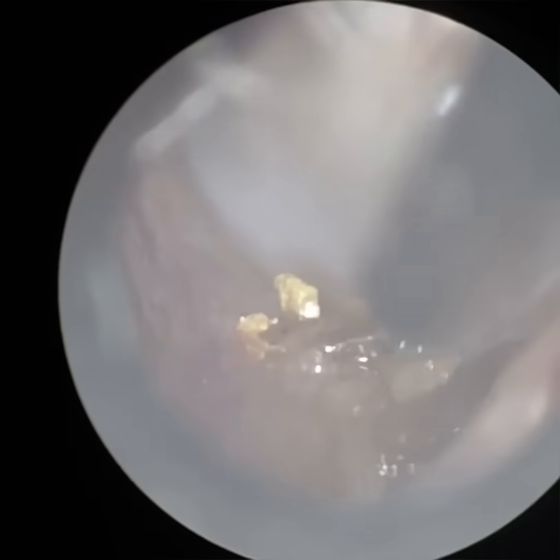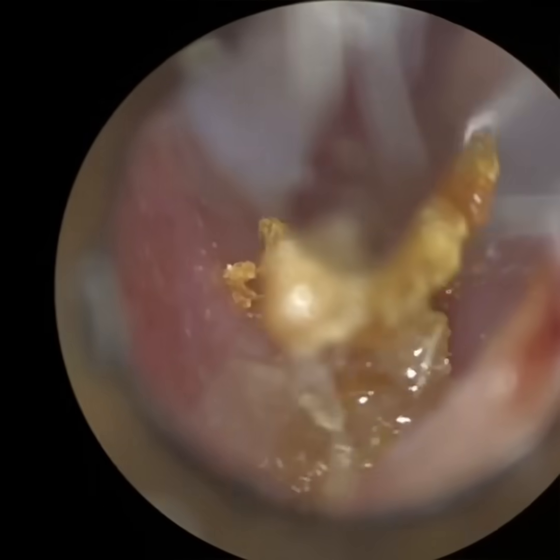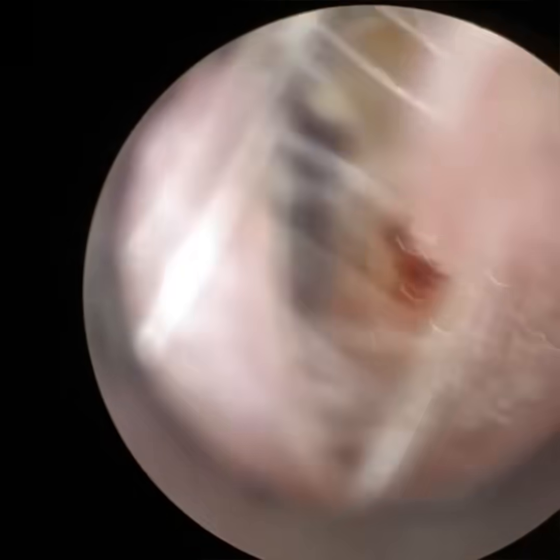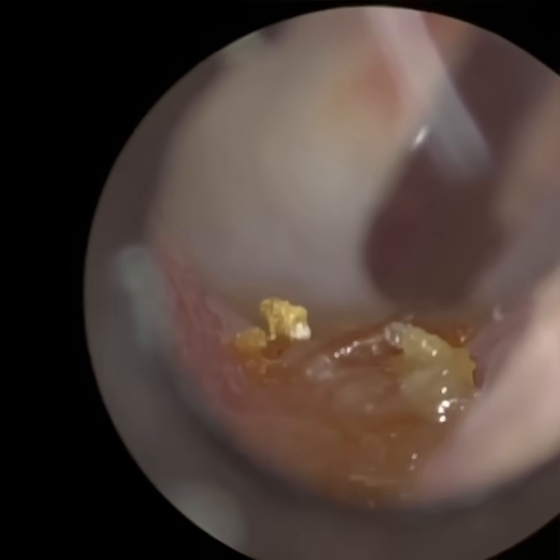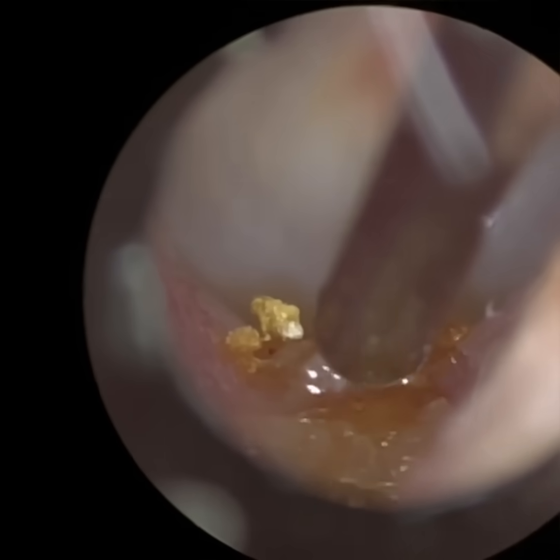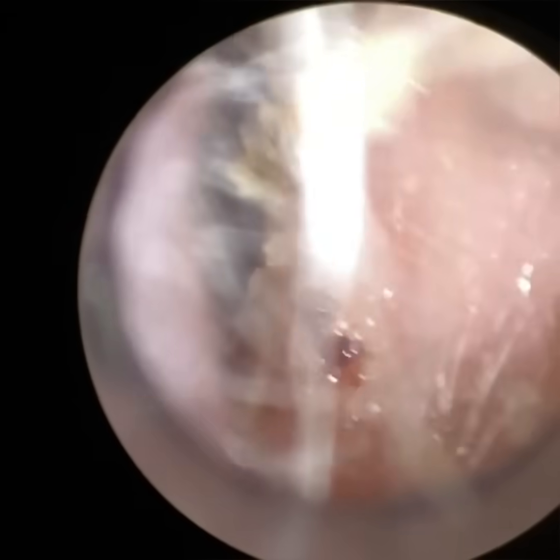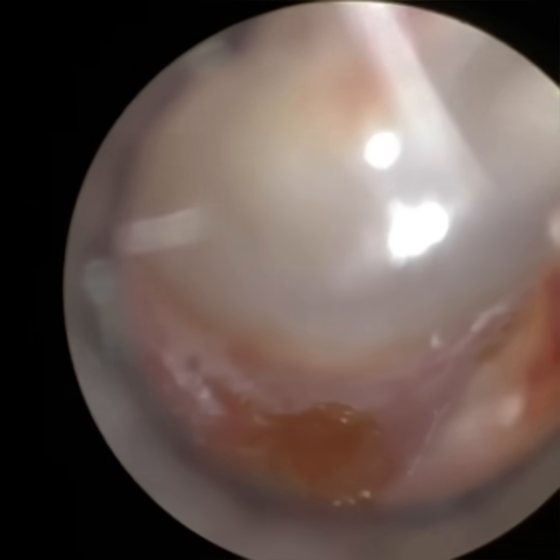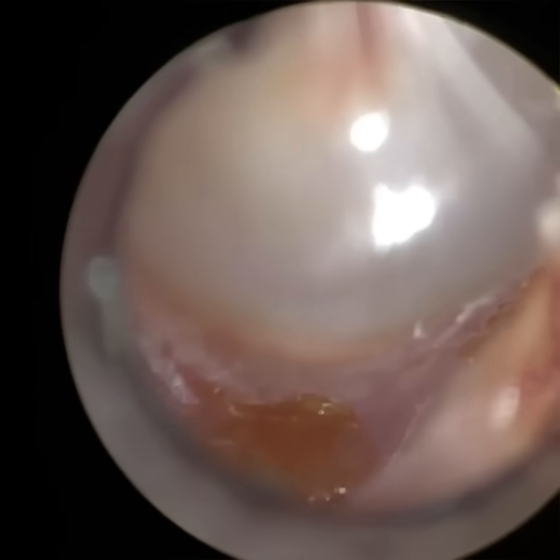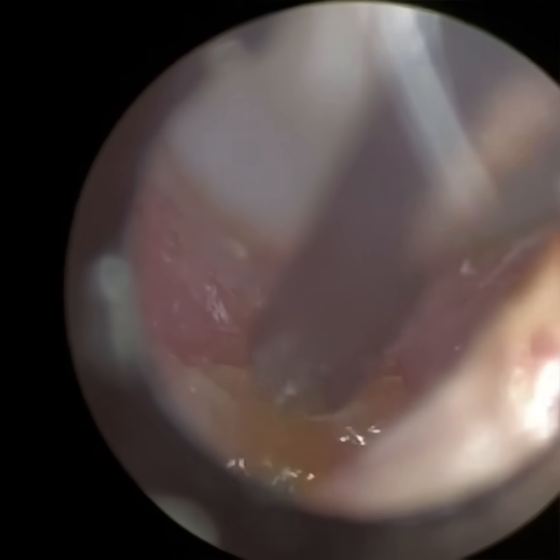They probably got a very poor quality light source. So the light source is like a torch. It's attached to the bottom of the WAXscope, and it acts as a handle. And then we've got fiber optical cables running through the WAXscope, like the endoscope, projecting this light, channeling it into the ear. But if your light source is of poor quality, then the image on screen you're getting is not bright enough. So on the app itself, you can increase the brightness, but by increasing the brightness, the exposure, what you're actually doing is slowing down the shutter speed of the iPhone camera. And when you slow down the shutter speed, it allows more light in, so it makes things brighter, but then you also experience a lag.